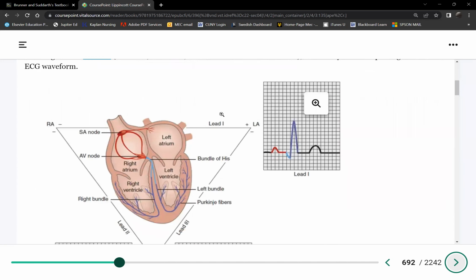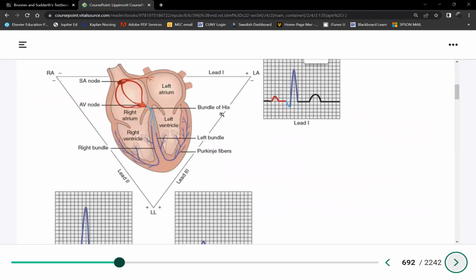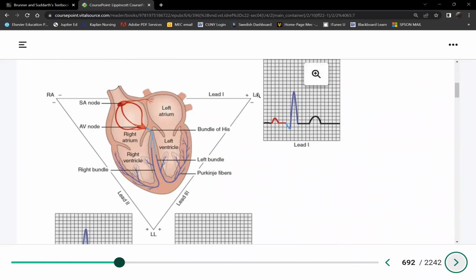Now, long story short, because it's a long story to explain the Einthoven triangle. So this is the Einthoven triangle. It's called that because of the person. He's given credit for inventing the 12-lead ECG. And he explained it via the Einthoven triangle. So it's an upside down triangle showing you the interactions between positive and negative terminals of the 12-lead ECG.